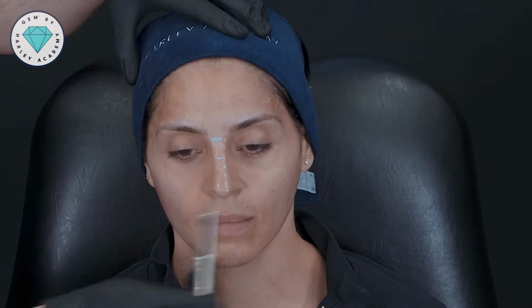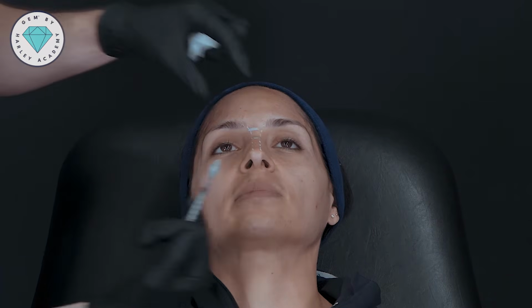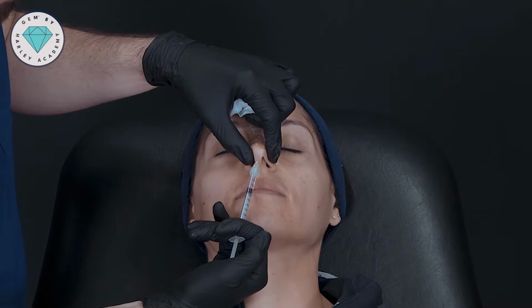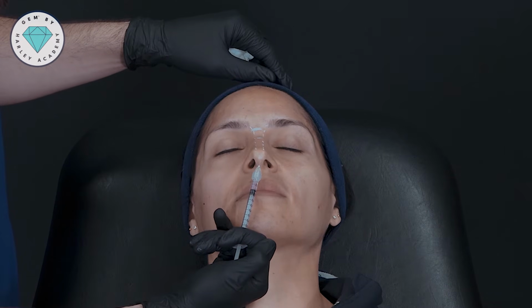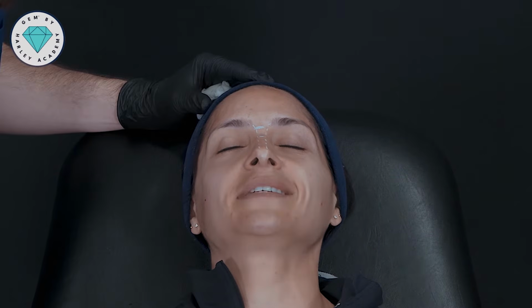Now I've got my landmarks in place. We're going to make a cannula entry point, and I'll show you how I treat the nose. So I like to use lidocaine just at the tip of the nose, and my entry is just underneath the tip. A little bit of a sting there, Lara. Okay. Stingy? A tad.